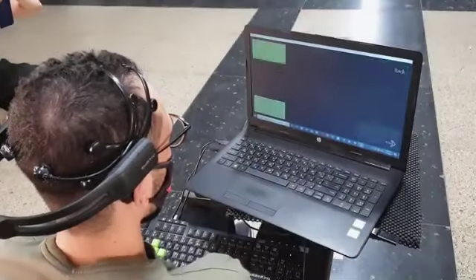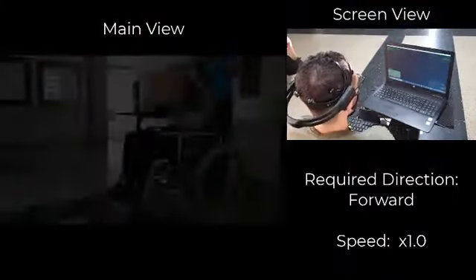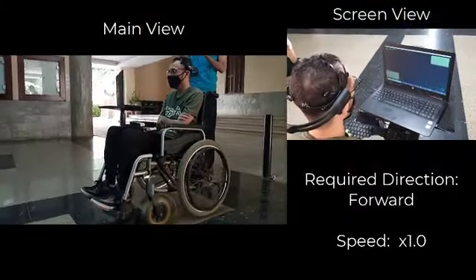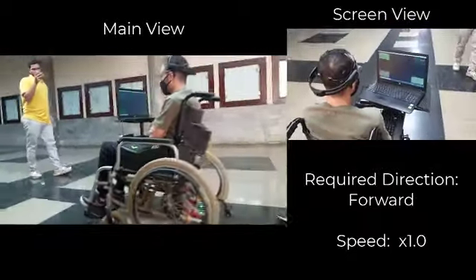In our first demo, we show the manual mode of the wheelchair. In this mode, a screen has 4 flashing boxes as shown here. When the user looks at one of the 4 flashing boxes, the system registers the command corresponding to the box that the user is looking at, and the wheelchair can execute the requested instruction.